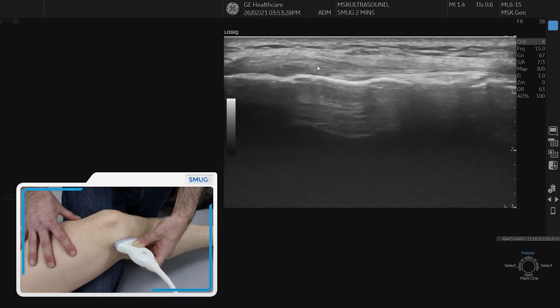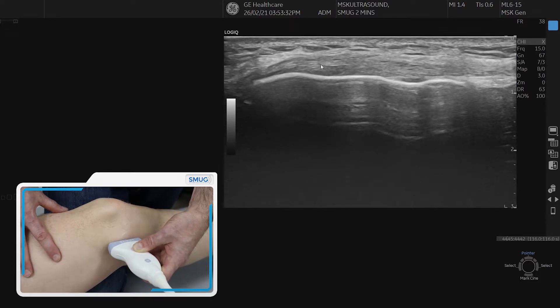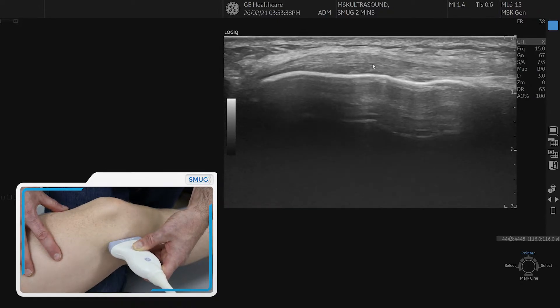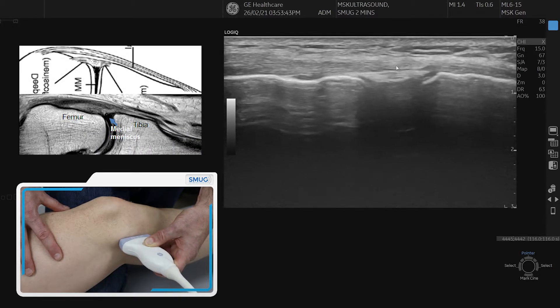First of all, we're going to line up so we can see a nice thick bit of what is the MCL — the superficial part on the femur side. You can see the longitudinal fibers quite nicely; follow it all the way up to the proximal attachment and back. Then we go to the joint line again, where you can see the superficial layer at the cursor position.